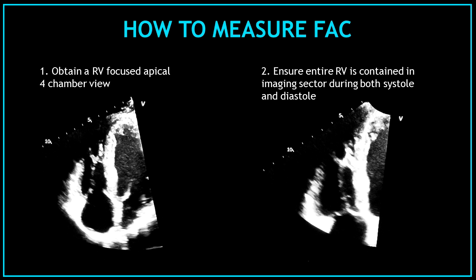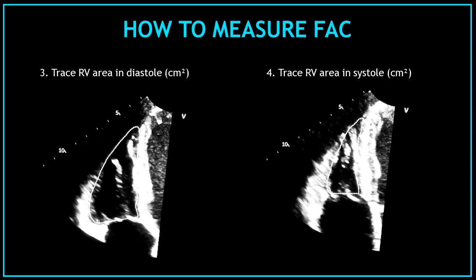How to measure the fractional area change: First, obtain a right ventricular focus apical four-chamber view. Second, always ensure the entire right ventricular area is contained in the imaging sector during both systole and diastole. Third, trace the right ventricular area in diastole. And fourth, trace the right ventricular area in systole.